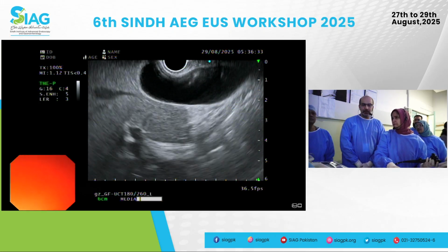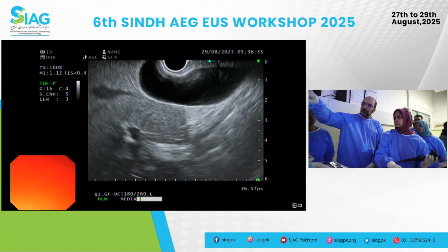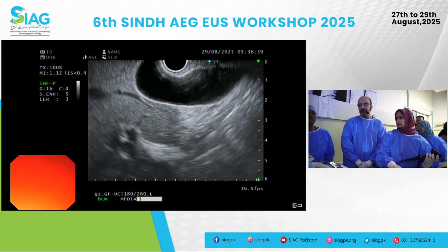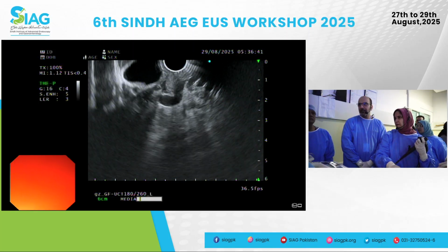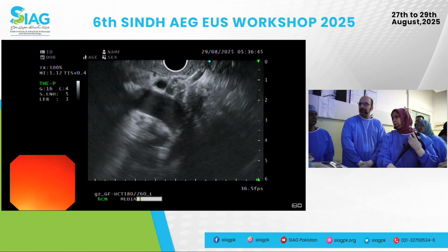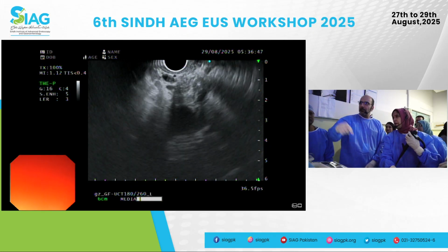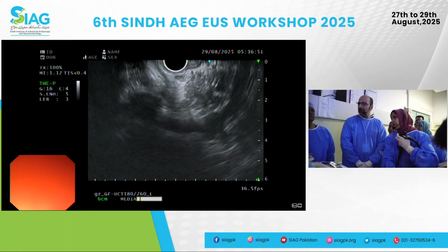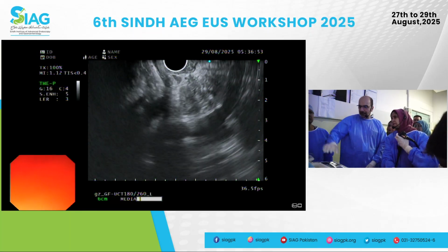It's gallbladder. Good. What about the structure that was behind it that went into the liver? Go clockwise again. Cystic or... Okay. Sure. Okay, keep going clockwise for a second. Yeah. Keep that in view. Good. You have it in view. Keep going clockwise. Keep going clockwise. Keep going clockwise. Okay, what is this?